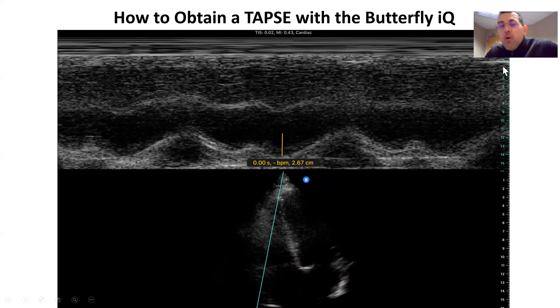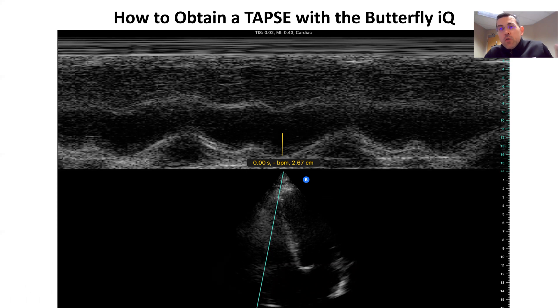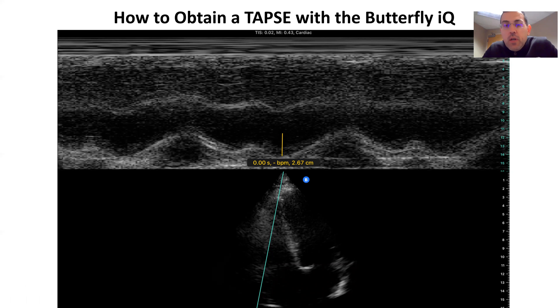When we have that tricuspid annulus in view, we can go ahead and put our M-mode on. M-mode is just a single dimension of ultrasound, in comparison to the 2D mode of ultrasound that we just saw in our prior image with the apical four-chamber view — that's a 2D image. With some of the more sophisticated machines these days, we can get 3D images. But for M-mode, it's a single dimension.